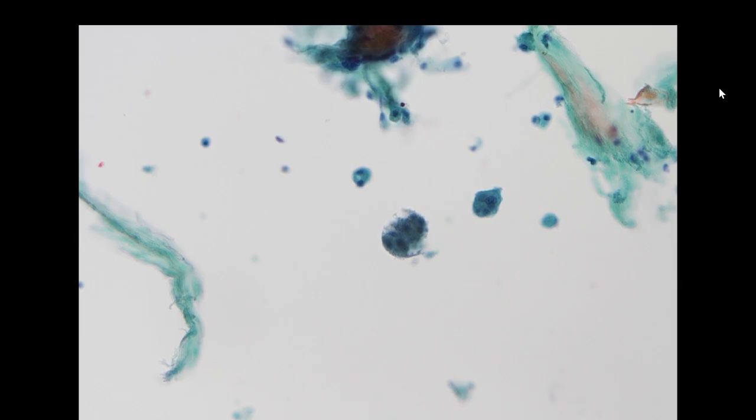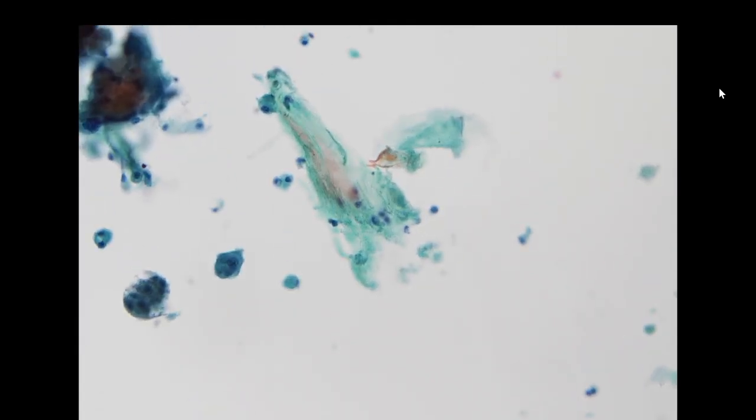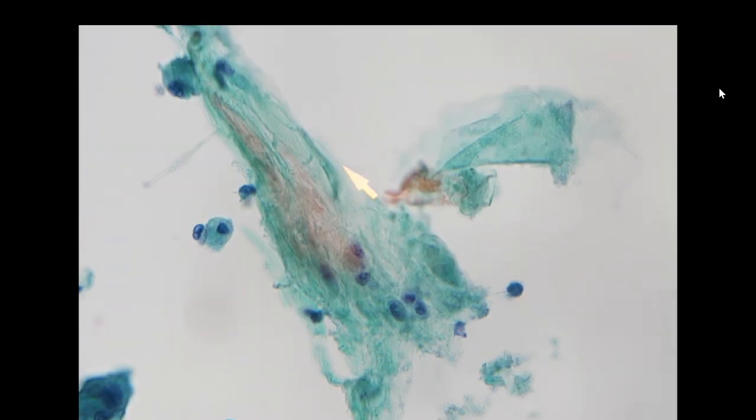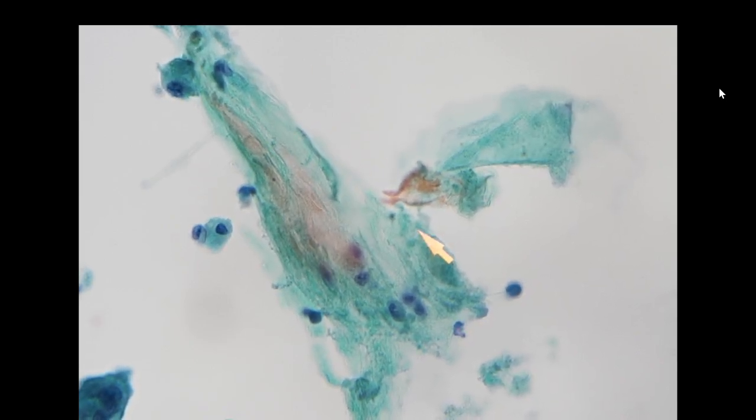So it seems to have a granulomatous inflammation with a cystic change. And then you move to the adjacent material. What is this? So you start to see there is some lamination. So this is actually a degenerated keratin material.